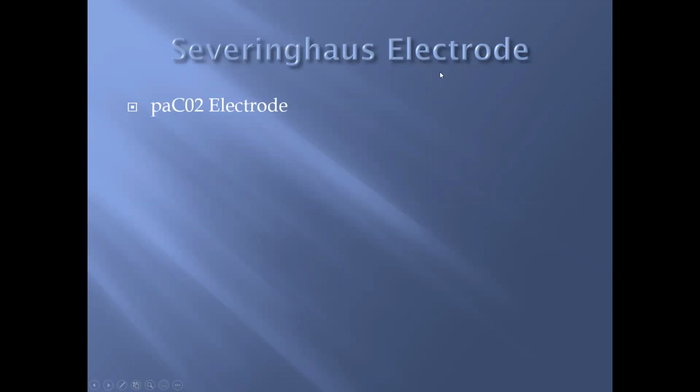I don't know if they still put this question on the NBRC. You analyze a blood gas using the Severinghaus electrode, and what would you expect for your value? I don't know, they come up with something stupid like that. And what they're looking for is that another name for the CO2 electrode is the Severinghaus electrode. So that's been around probably 15, 20 years. I'm hoping they don't still have that on the exams, but there it is if you need it. Another name for a CO2 electrode in the blood gas machine, the Severinghaus electrode.